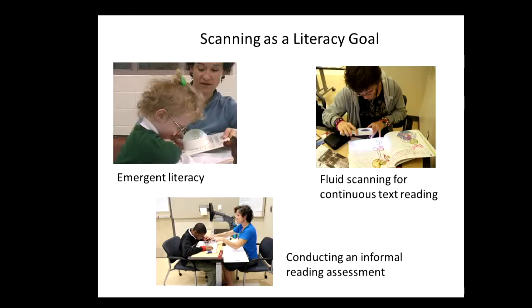text. On the top right, a student has a number of devices in front of her and is conducting her own trial and error session on what is the magnifier that is comfortable for me with this kind of material. There are a number of factors that she has to consider here, such as the size of the lens. Some of them are rectangular and you can fit more words in that lens, which is very important.